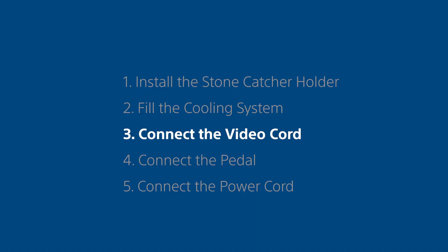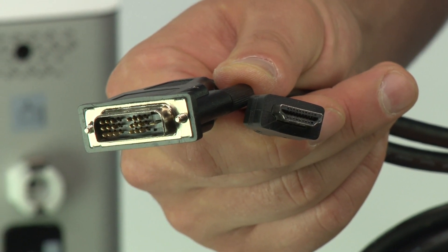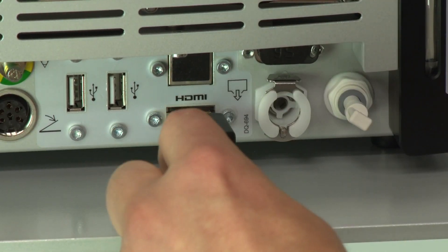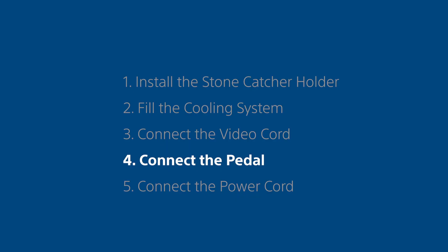Step 3. Connect the video cord. Connect the video cord to the HDMI connector at the rear of the unit and to a video monitor that supports picture-in-picture.